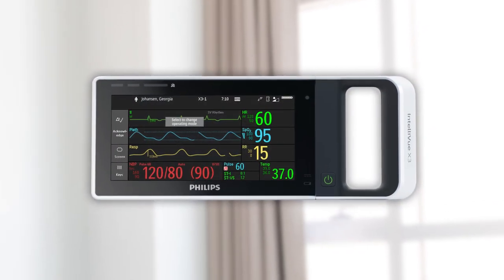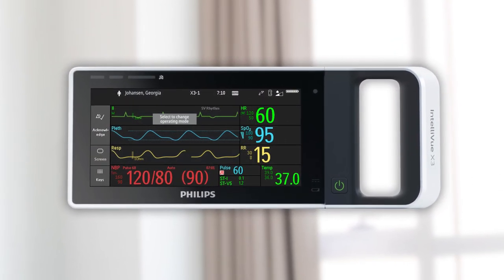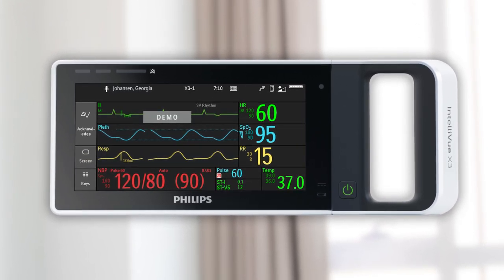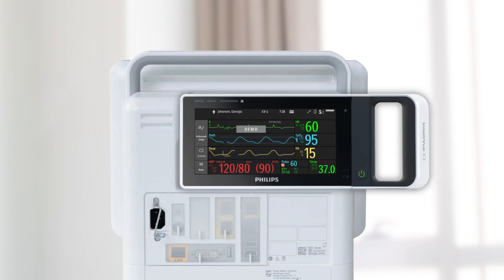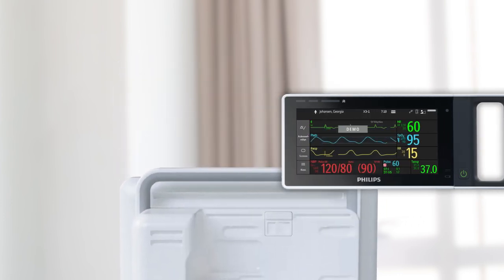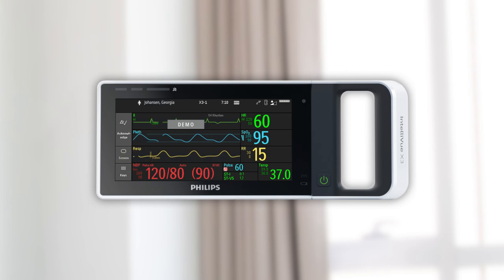The X3 can function as a stand-alone patient monitor or as a multi-measurement module for the Intelliview family of patient monitors. When the X3 is attached to a host monitor, it is in companion mode and, if configured, may show active patient data. Disconnecting the X3 from the host monitor allows for interaction with the X3 device.